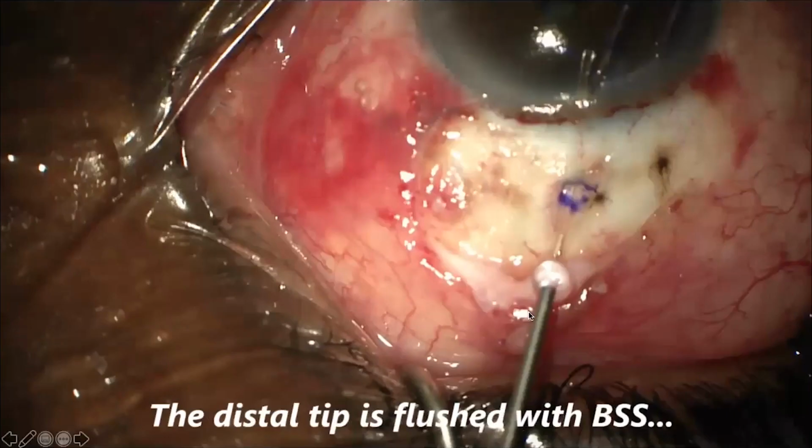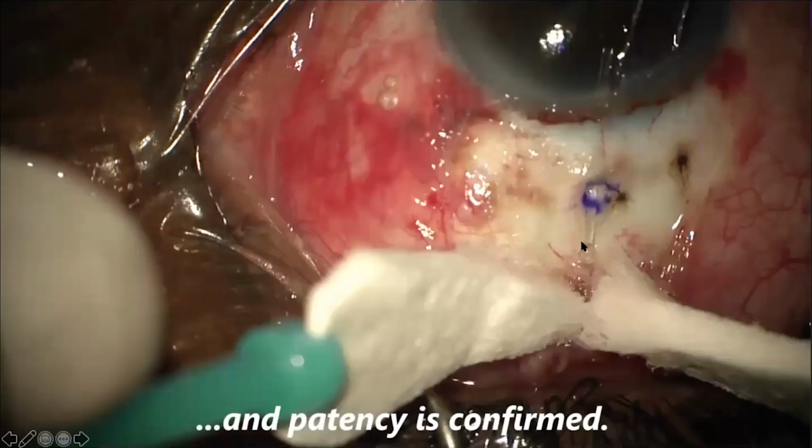We want to, again, prime the device. So you're going to take BSS on a cannula. You're going to go over the distal end of the device, and you're going to back flush into the anterior chamber. And what you should then see is a reflux of fluid coming from the distal end. This is the percolation of flow that we want to see.